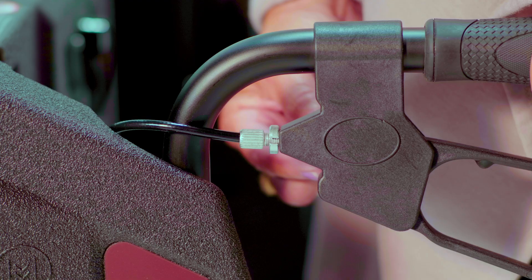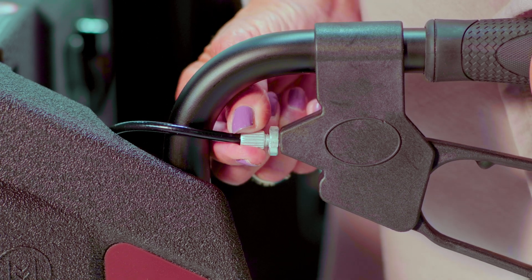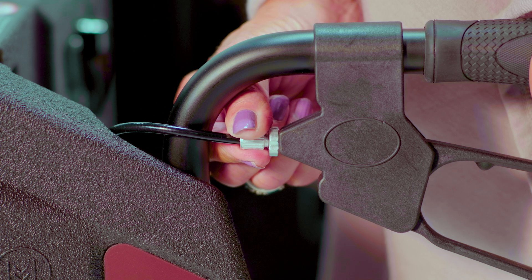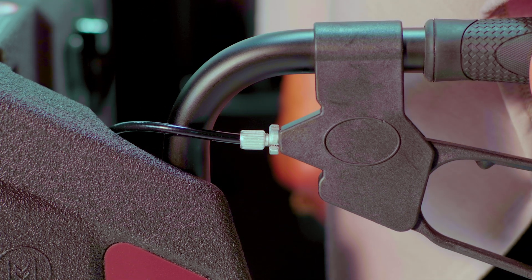For less tension and to move the brake shoe further from the wheel, turn the cap counterclockwise. When adjusted, retighten the lock nut. Remember, the brakes are factory set and you only have to do this if needed.